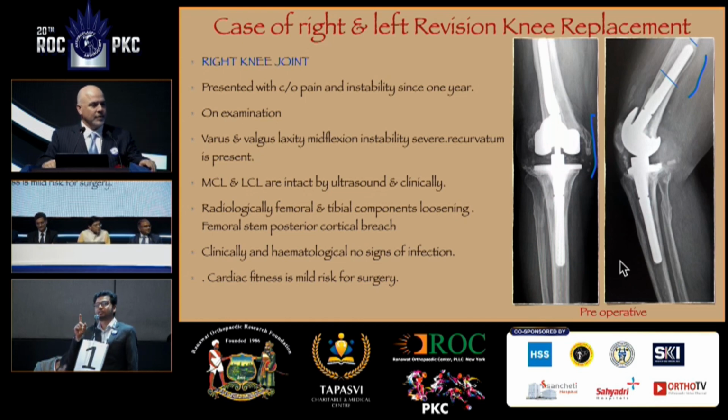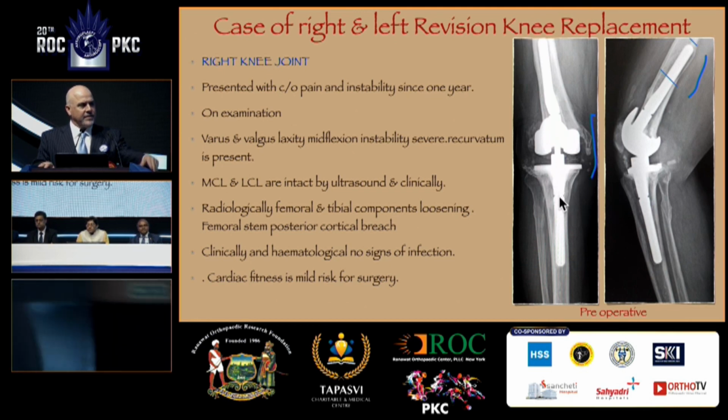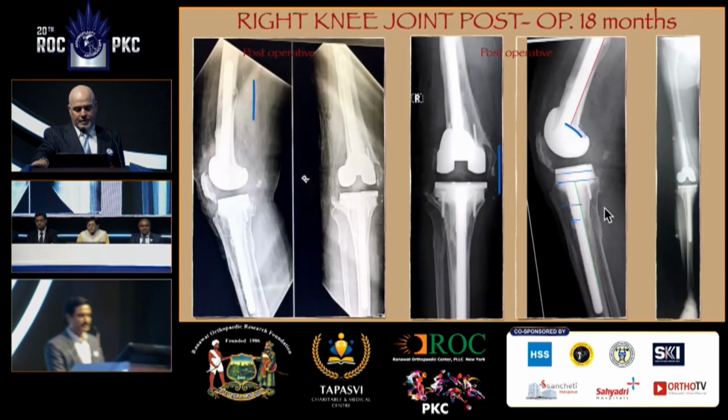Sir, what was the post-op range of motion of this patient? I'll show you later. Okay, so let's go. It's a right side. Already 3 years back underwent 2-stage revision. You only get one case. Let's go. These are the intraoperative pictures. These are the post-op X-rays, 18 months.